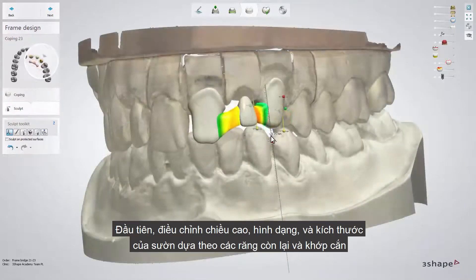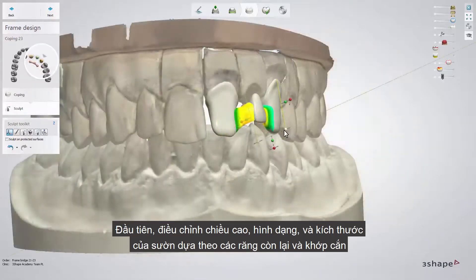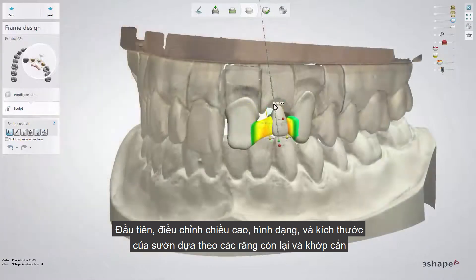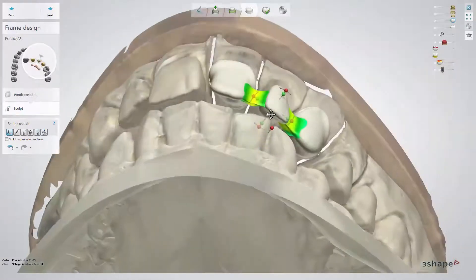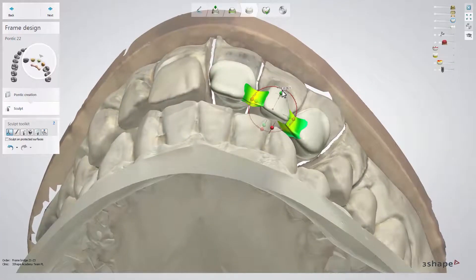First, adjust the length, shape, and size of the coppings according to remaining teeth and occlusion. Then do the same for the pontic.